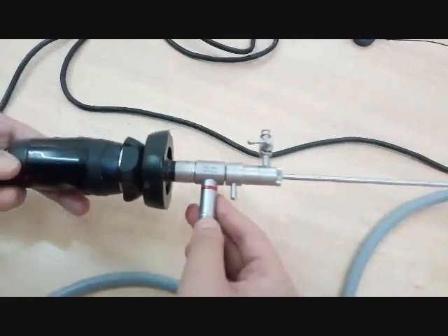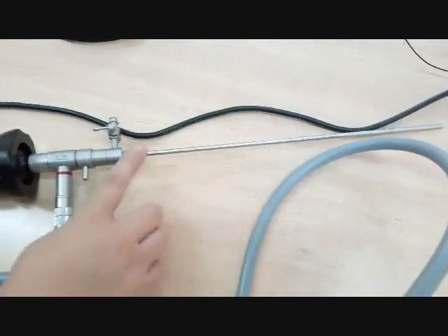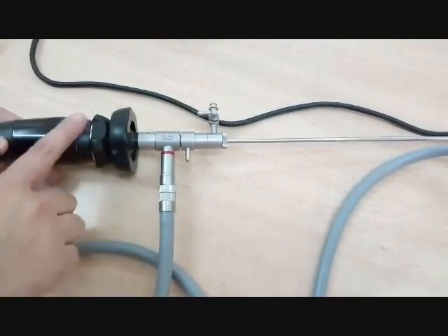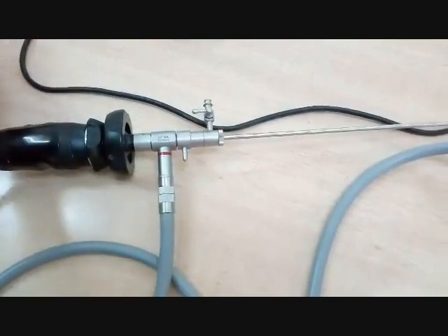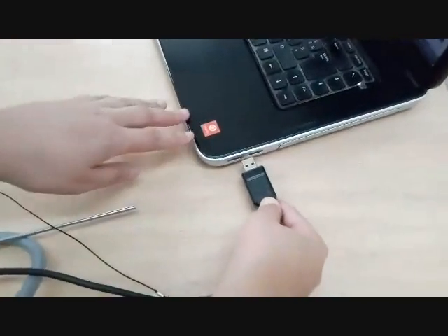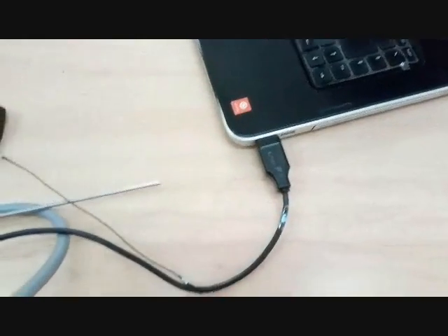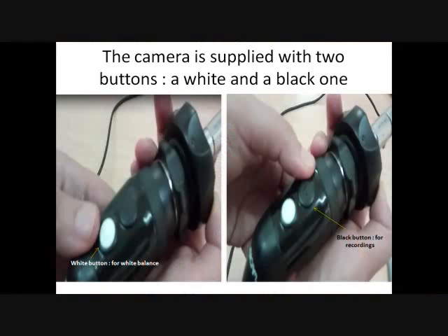So here we go. We have a scope in its diagnostic sheath, the light attachment, and the camera. We hook up the camera to the laptop. Sorry, I first screwed up, but then it was all right. Besides, the camera is supplied with 2 buttons, a white one and a black one. The white button is for the white balance. The black one is for the recordings. These buttons should always be kept up.